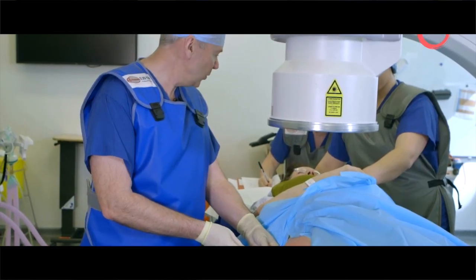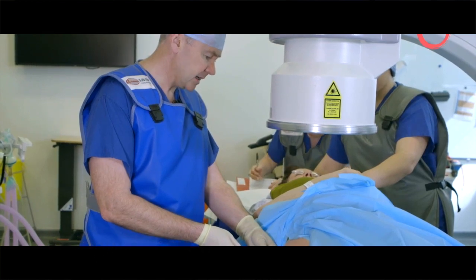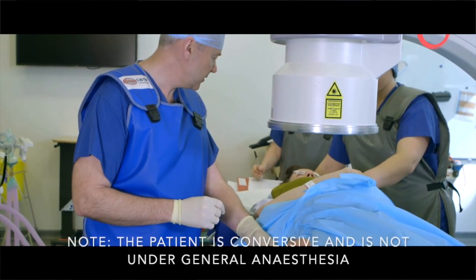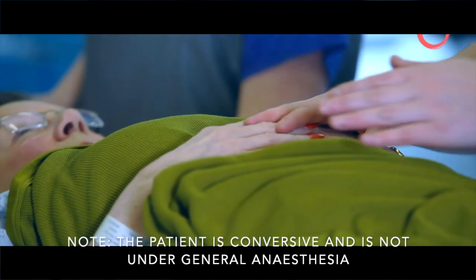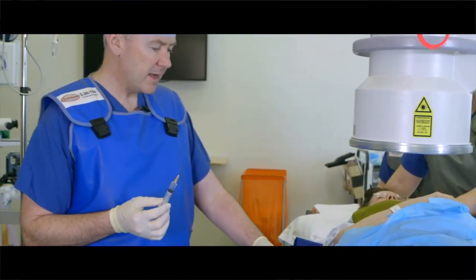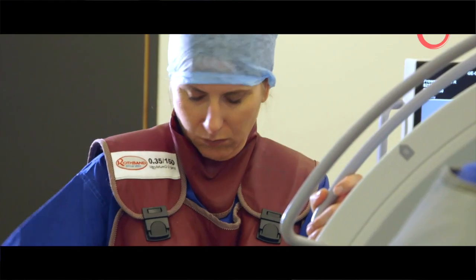Do you feel anything at all? Let me know. A little bit stingy. Let me know when it starts to go off a bit. So we're using a local anesthetic to numb the skin on the outside, and then we're going to let that work for a few moments before we introduce the needle.